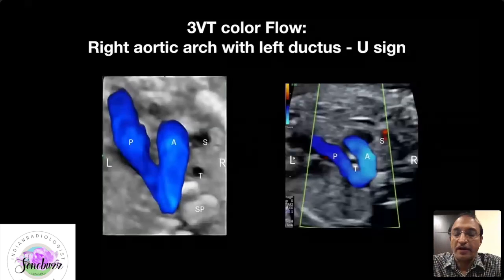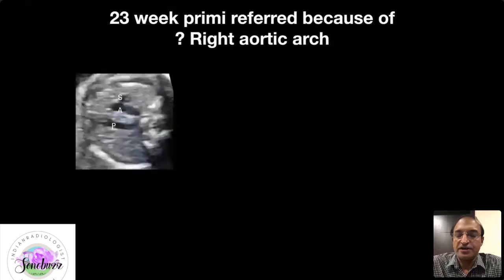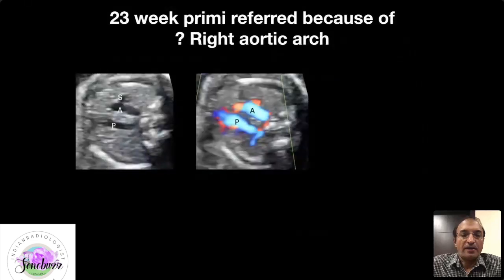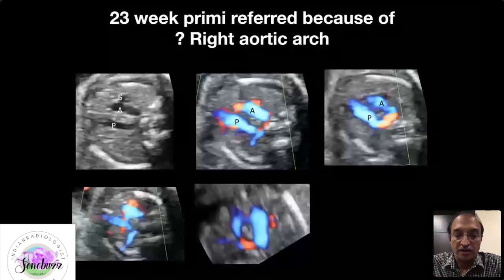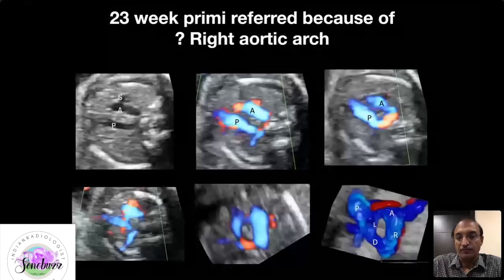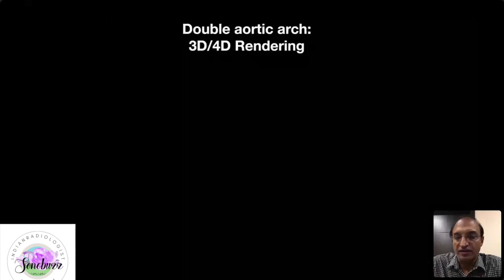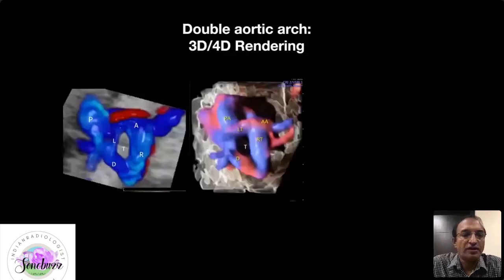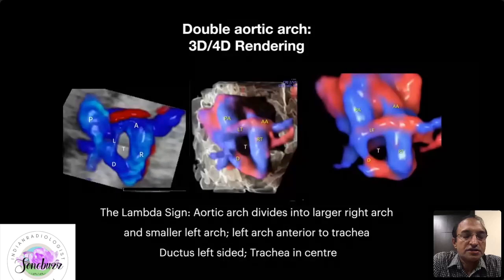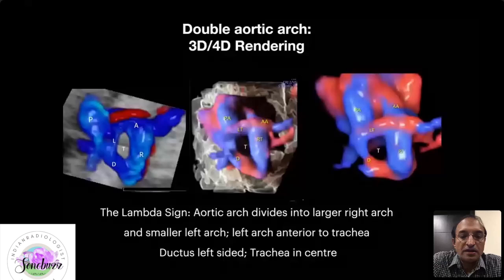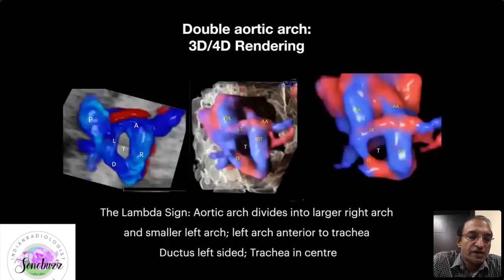Another example looked very similar to the right arch, but moving toward the three-vessel tracheal view revealed increasingly complex pictures. The 3D rendering showed a lambda sign — the aortic arch divides into a smaller left arch (marked L) and a larger right arch (marked R). These two arches form a complete ring around the trachea (marked T), and the ductus arteriosus (marked D) completes the lambda sign.